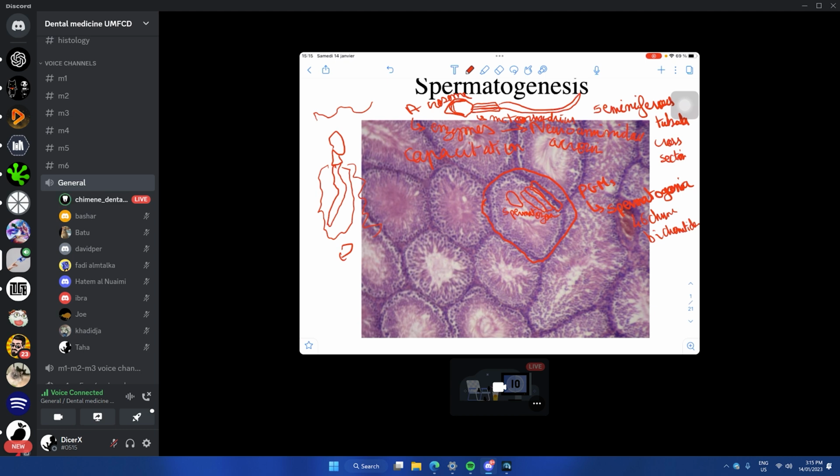So let's get back to our picture. So if your professor asks you what those filaments in here are, those filaments are the sperms, okay, the spermatozoa, and the filaments are the tails of the sperms. And here I can see like a light in here. This is called the lumen. Lumen stands in Latin for light, okay, lumina in Romanian. So in the lumen, the sperms are going to be released. Okay. What else do I have to tell you about in this picture?